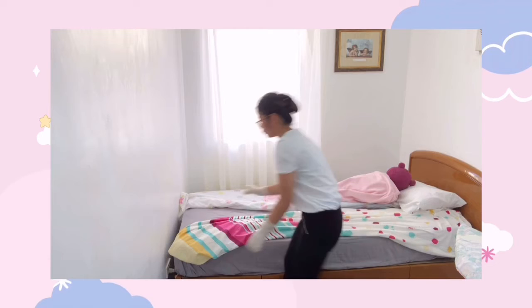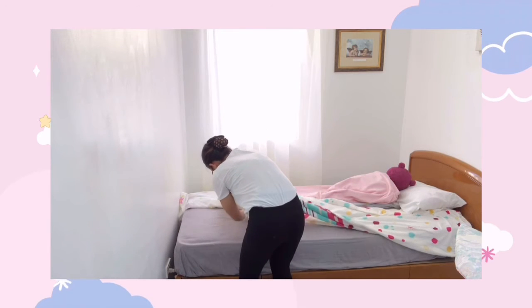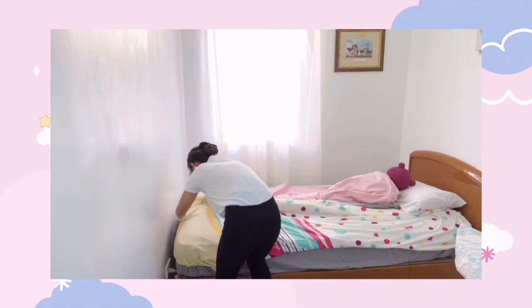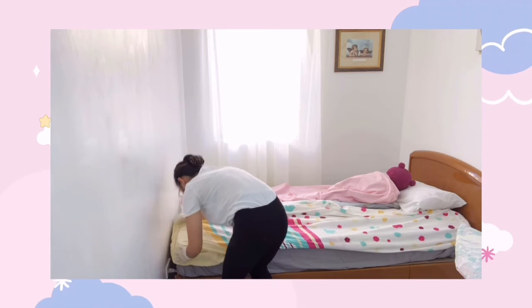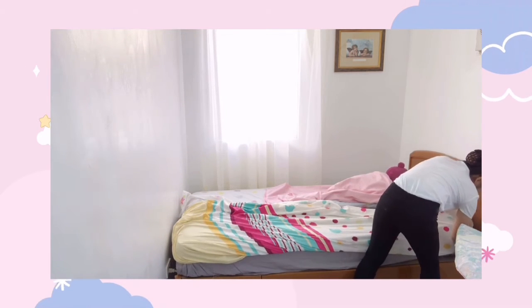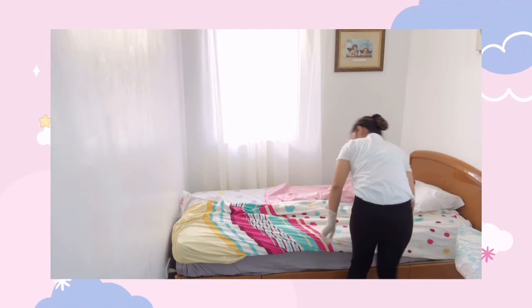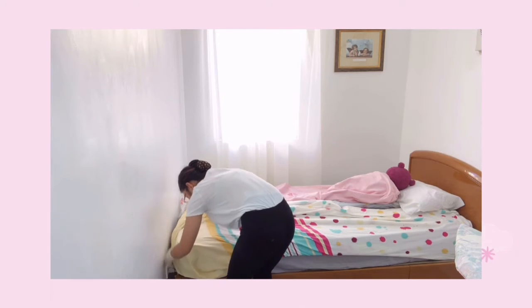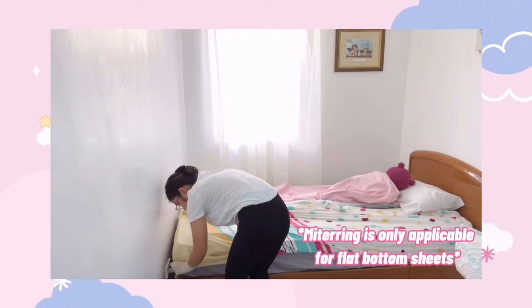Seven, you're going to miter bottom sheet at the head of the bed, then at the foot of the bed. To miter, lift the mattress and tuck the sheet over the edge of the mattress. Lift the edge of the sheet that is hanging to form a triangle, and lay upper part of the sheet back onto the bed. Tuck the lower hanging section under the mattress. Repeat for each corner. Tuck the sides of the sheet under the mattress. This holds the linens firmly in place.